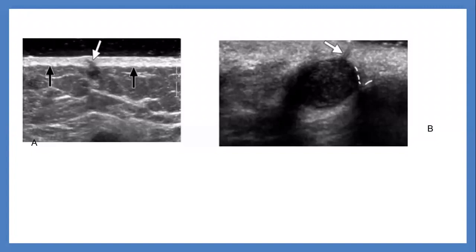And this tract indicates the hair follicles. When we have seen this, we need to use the gel pad and angulate the probe to see this. When we have seen these signs, it is very supportive that this is a dermal lesion, even if the epicenter of the lesion is in the hypodermis.